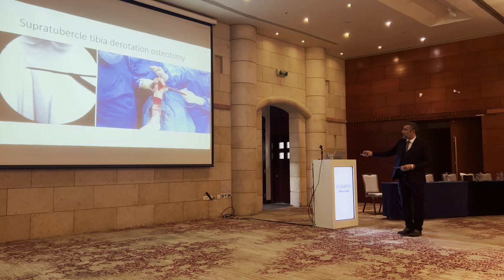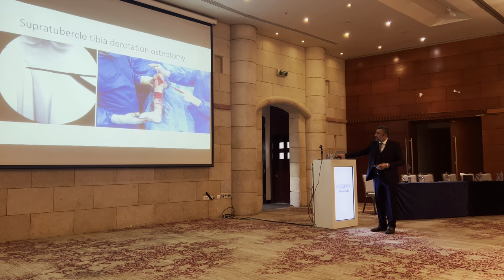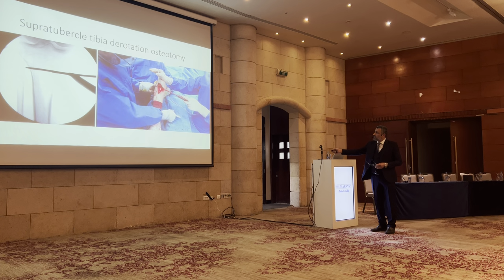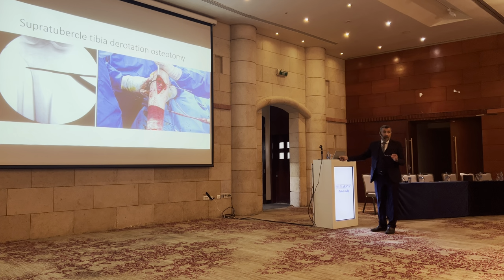So we correct both. Look here to the medial, look to the external torsion, and here we define the degree by millimeter, because there's a conversion.